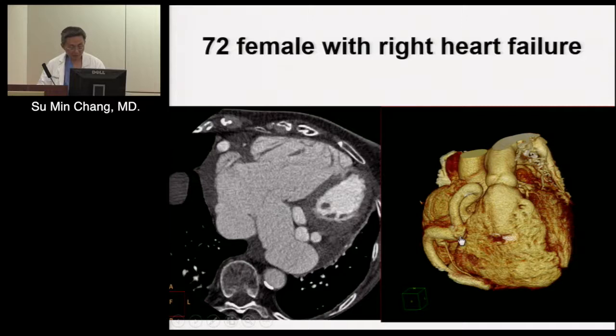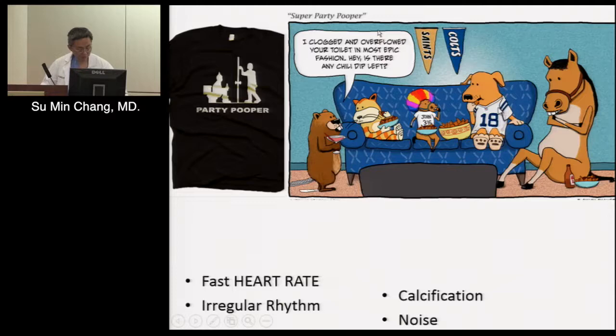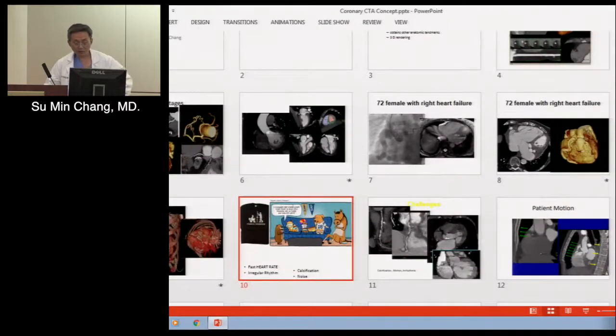But I think the most important part is the next picture that I was going to show you. With this 3D display, you can pinpoint exactly where the right coronary artery communicates or drains into the coronary sinus, right here, and its relation with the descending aorta. So it's very useful for the surgeon, to know exactly where to go and ligate this structure.